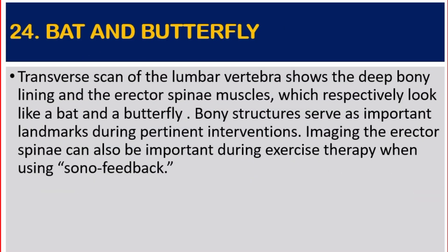Number 24: Bat and Butterfly. Transverse scan of the lumbar vertebra shows the deep bony lining and the erector spinae muscles, which respectively look like a bat and a butterfly. Bony structures serve as important landmarks during pertinent interventions. Imaging the erector spinae can also be important during exercise therapy when using sono-feedback.